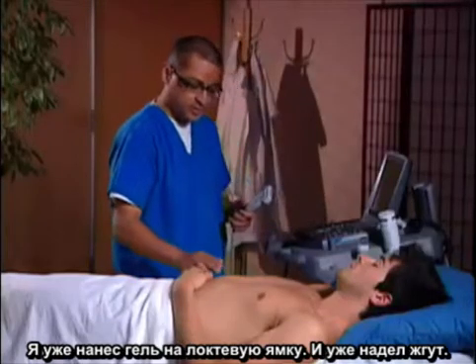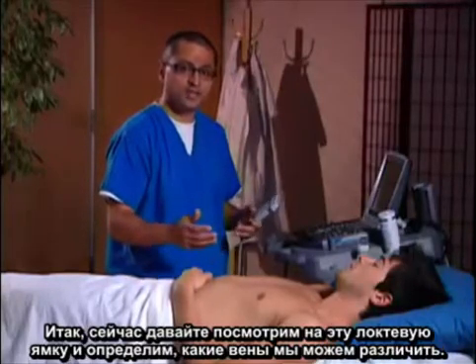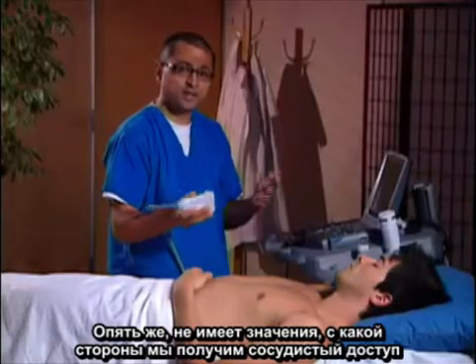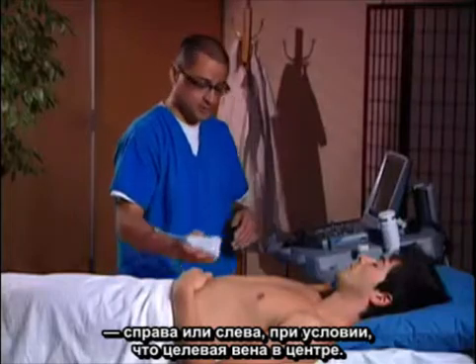I've already got some gel at the antecubital fossa and a tourniquet up. Let me now take a look at the antecubital fossa and see what veins we can identify. The transducer marker is here — I'm going to put it to the patient's right. It doesn't really matter when we do vascular access if it's to the right or left, as long as the target vein is in the center.